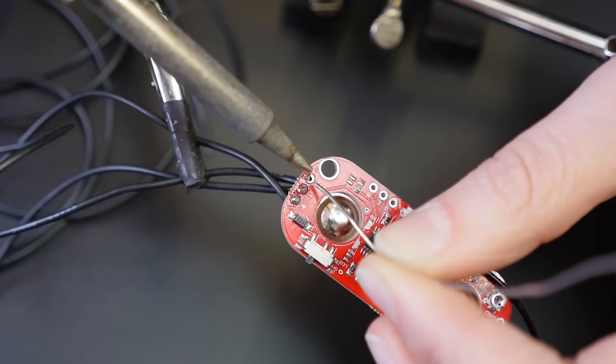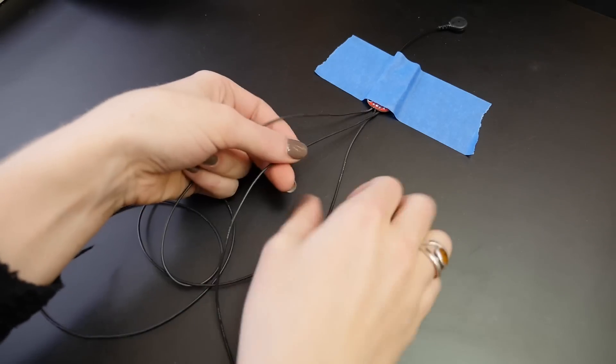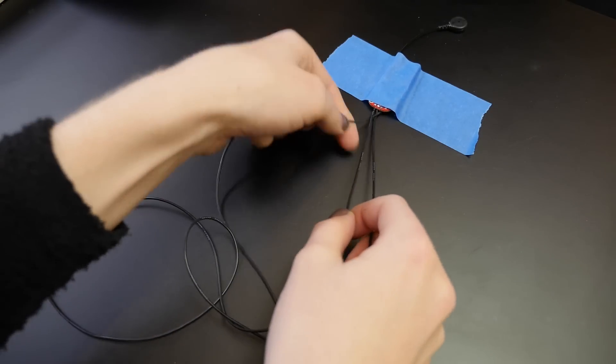The sensor outputs a signal that can be read by any analog input pin. We're using silicone coated stranded wire to connect up the power, ground, and signal pins.